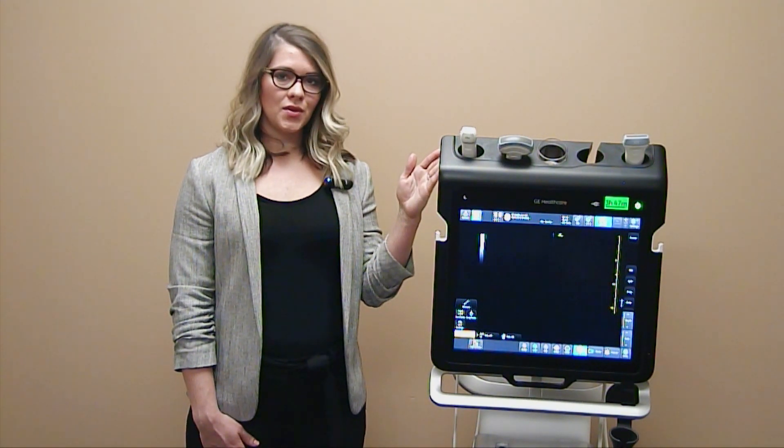Hi, I'm Gina, Clinical Sales Specialist for Point of Care Ultrasound. I'm going to be introducing you to the Venue.